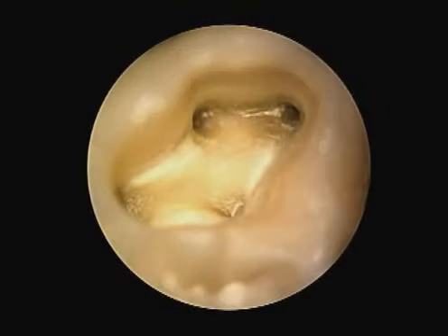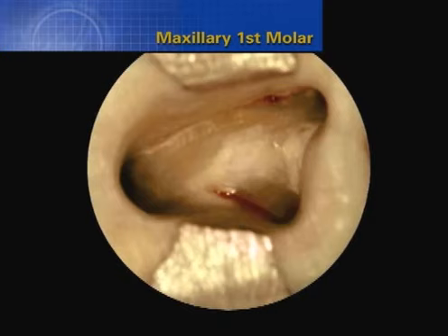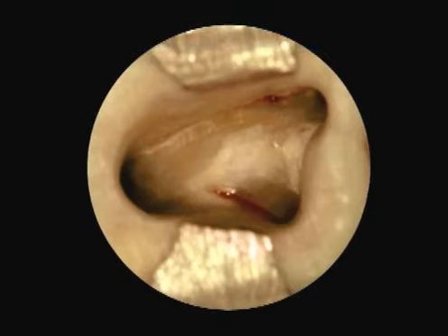Clinically, when we use ultrasonic instruments, they generate debris. We call it the white line test because in necrotic teeth, dental debris moves into the isthmus area and makes a white line. When we track the white line, it will roadmap and lead us to the MB2. In vital cases, blood will frequently move into these isthmus areas and can be used as an indicator where the underlying anatomy is positioned. Notice the MB1 and related groove, but notice the long groove off the DB. We call this the red line test.